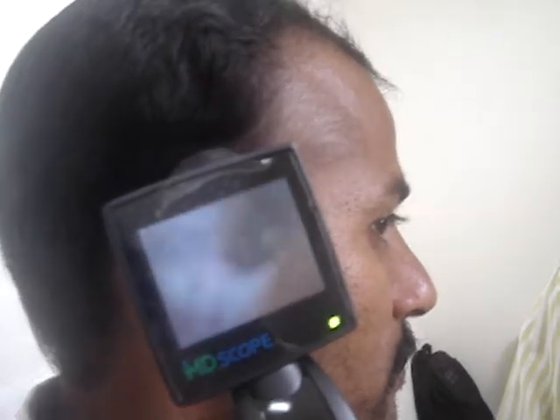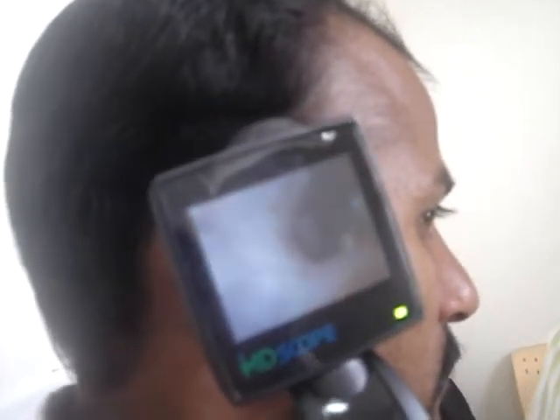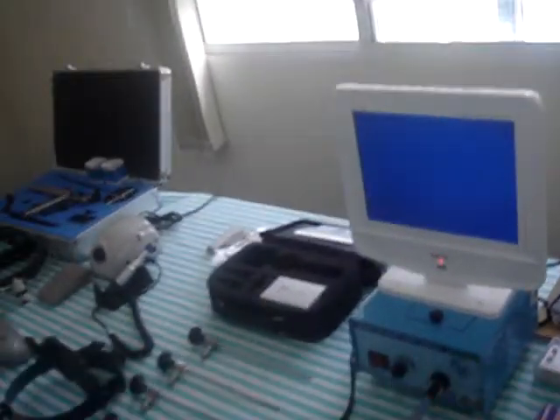Wonderful. This is an amazing experience. We can connect it to the monitor as well. You can examine the patients and you can show the view to the bystander also.